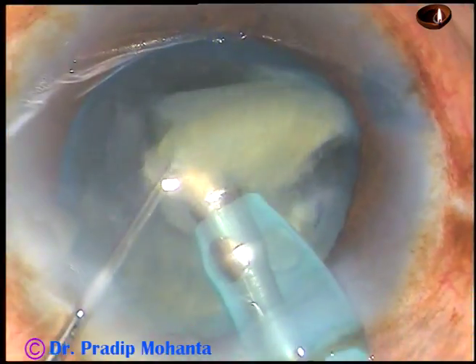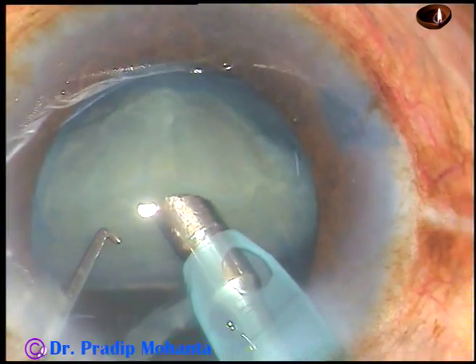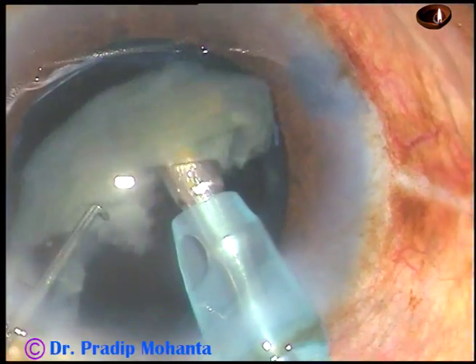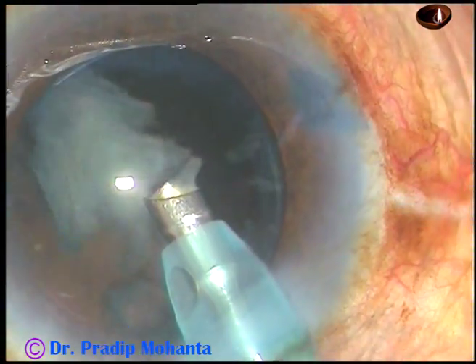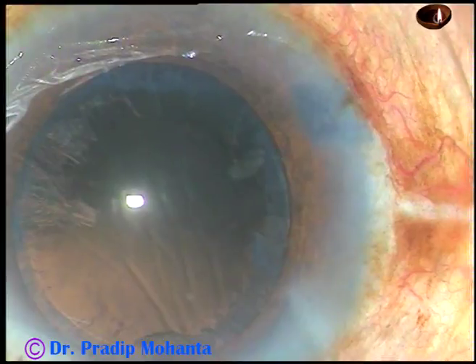Intumescent cataracts can have any type of nucleus — it can have a hard dense nucleus, it can have a grade 3 density nucleus, or this kind of soft, brittle nucleus. That's it — nucleus and epinucleus have been removed.